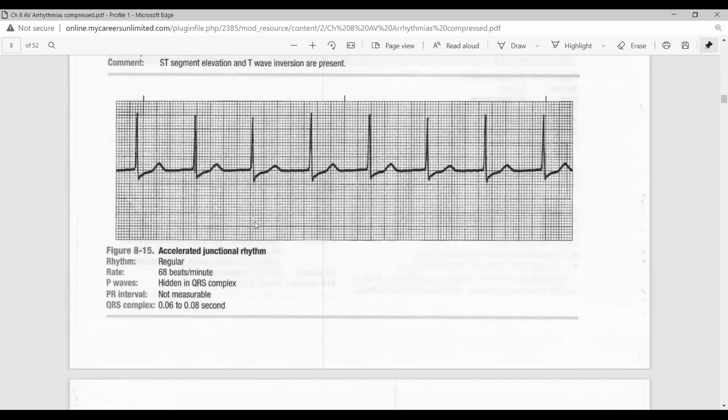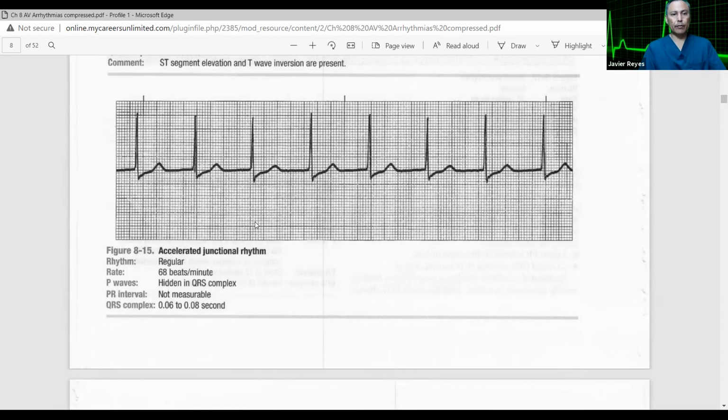The P wave is not visible. It's hidden somewhere; you can't really see it, right? The ST segment is also a little bit below the isoelectric line. It doesn't say on it, but it's a little bit, okay? So QRS, this is your S wave, okay? And then your T wave and so on.